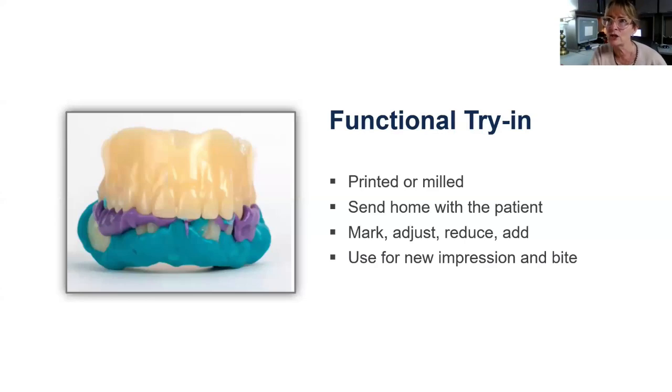Now, at this stage, you could potentially scan it, but I really wouldn't. I would take what you have right there, package it well, and ship it to the lab. I use the language digitally assisted a lot right now. If you're familiar with scanning at all, and I've been scanning for approximately 18 years, I figured it out the other day. I was like, wow, it's hard to believe that intraoral scanning has existed that long. Huge evolution in the technology in the last 12 to 18 months, just rapid changes, which is really exciting. And that's part of why we do programs like this, because it is ever changing.